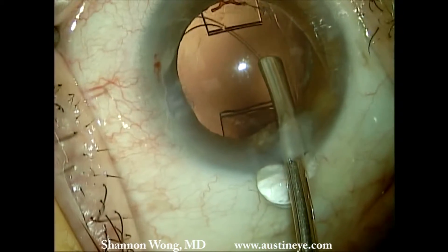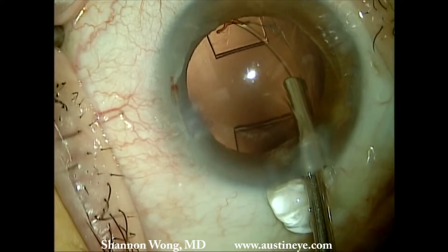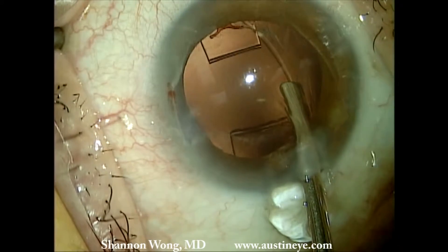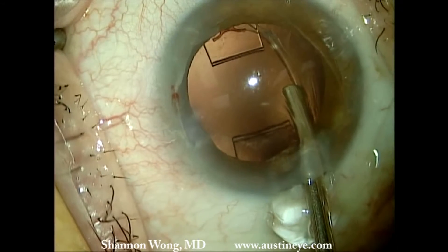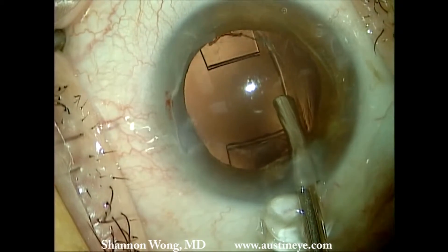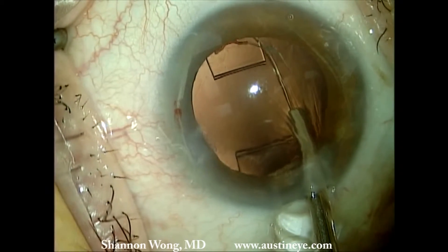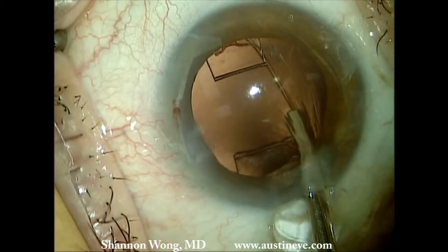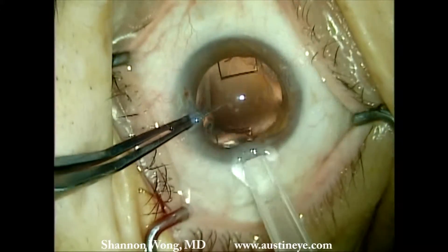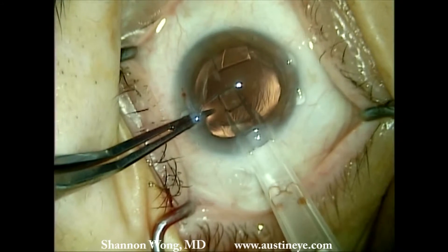Our plan is to place another crystal lens positioned 90 degrees away from the original crystal lens. In order to prevent a repeat Z syndrome, we elect to place a capsular tension ring to expand the capsular bag and prevent it from contracting in an abnormal way.